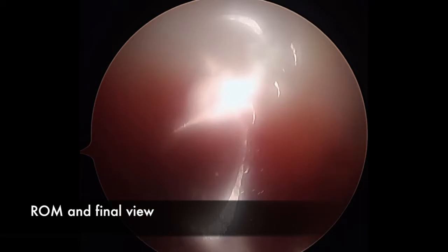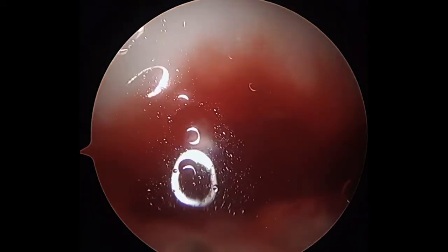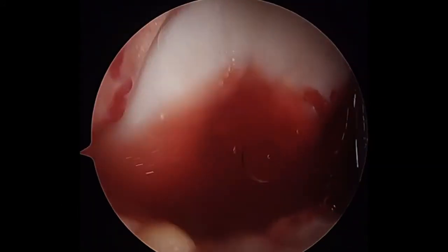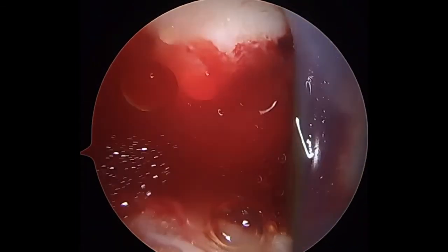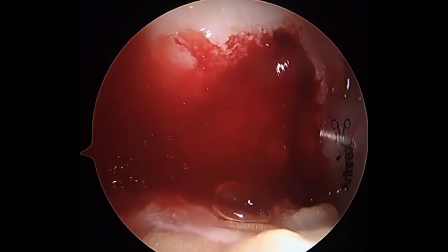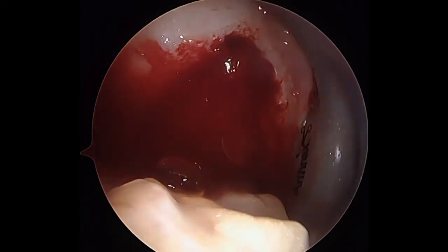After waiting 10 minutes for the CARGEL to dry, range of motion is assessed by cycling, bending, and flexing the knee. This final view of the CARGEL shows that it remained intact throughout these movements.